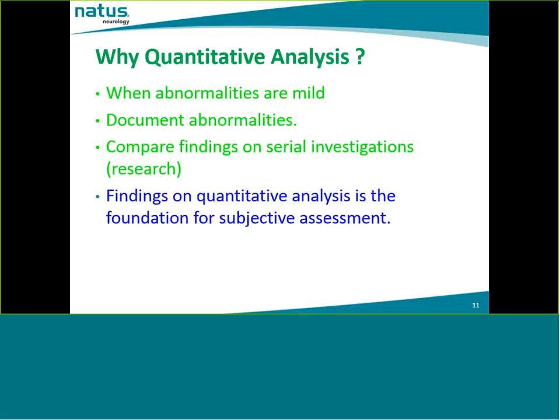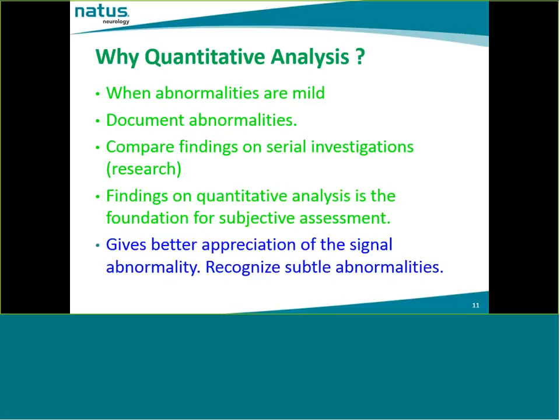It is important to note that the findings on quantitative analysis is the foundation of subjective assessment. One may argue that I never do quantitative analysis, I do everything subjectively. But that knowledge that was given when a person is taught subjective assessment actually comes from quantitative analysis. The rules of analysis were based on quantitative analysis. And in my opinion, when we know quantitative analysis, it gives us a better appreciation of signal abnormality. We can recognize subtle abnormalities. So I think knowing and practicing quantitative analysis makes one a better electromyographer.